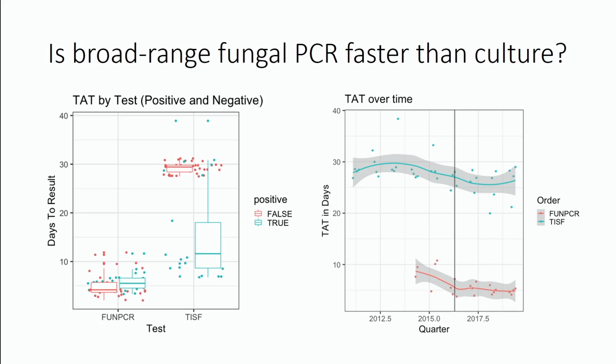And so I'm going to pick block A2, which is plenty of organisms. So I really think that's one of the key links between the molecular assays, the clinical lab, and the anatomic pathology side. One of the hard questions to answer with this process is, who wins the race? Is it PCR or is it culture?